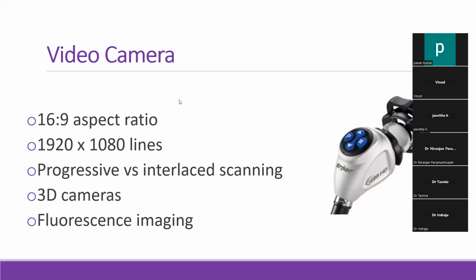Yes, sir. Image size of the screen, sir. Yeah. Height and width. 16:9. What are the other aspect ratios that you know of? Another 3:4. 4:3. Yes, 4:3. So what do these lines mean? 1920 × 1080.